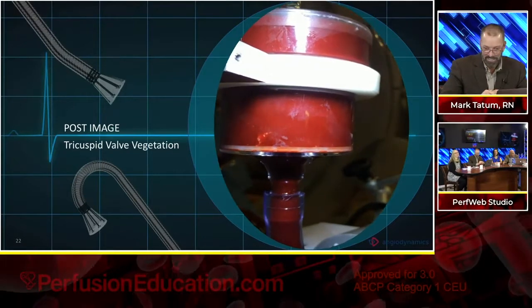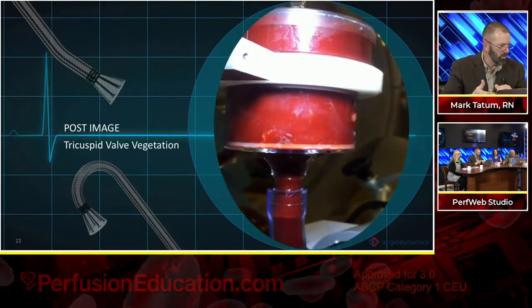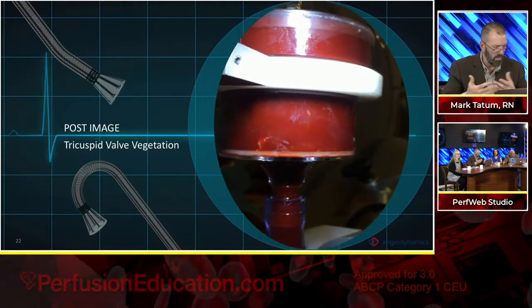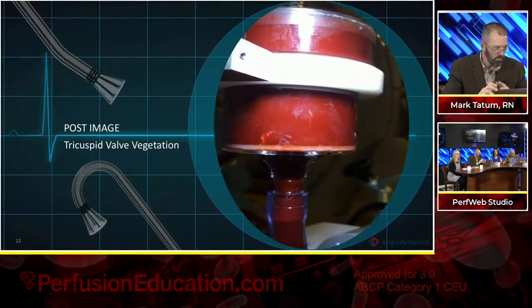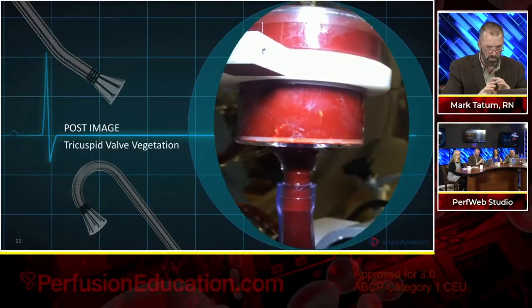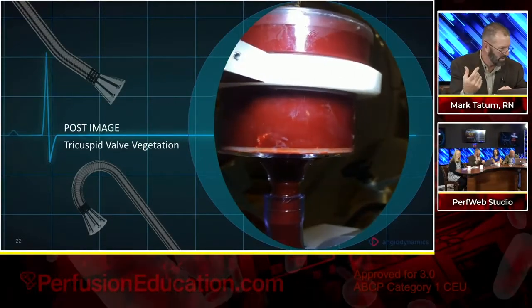So you can see the material floating around, and this is typically the presentation we're going to find when you have something with varying levels of chronicity. Obviously, if it's more chronic, it's white. If it's fresher, it's dark. But sometimes it becomes very difficult to see whether or not the material has actually been captured in here. It's really easy to see when it's white and it spins around like this.